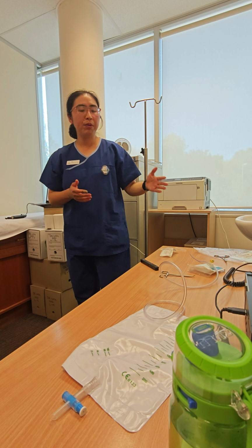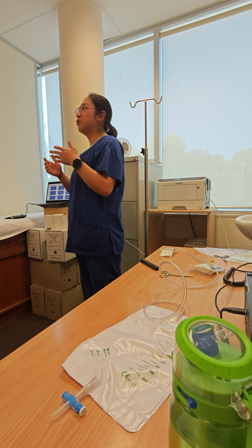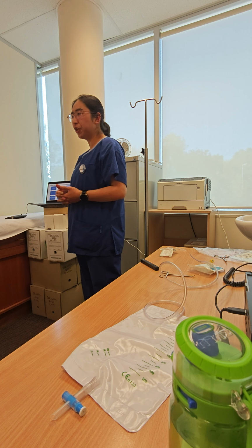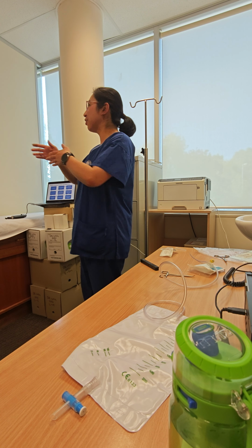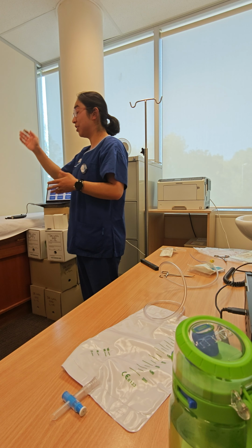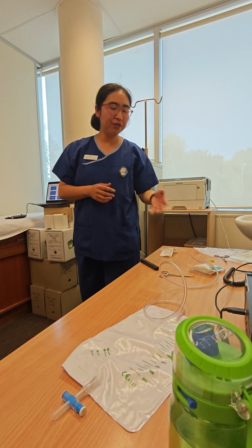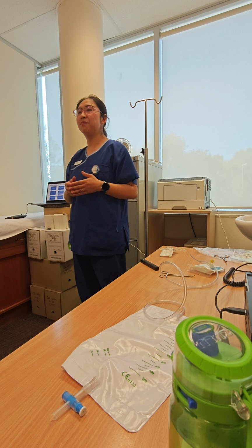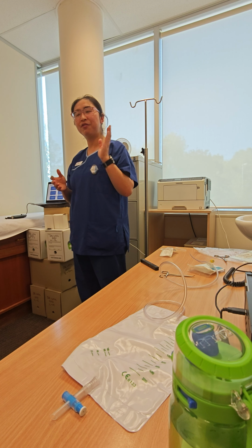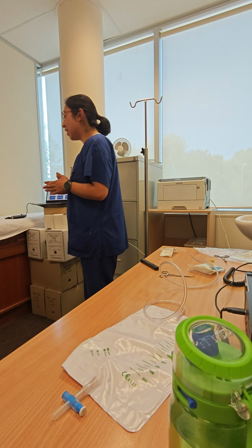What are we going to do? We might call the patient's surgeon to double check and get the authority to remove the catheter from their body. Once it's approved, we go into our nurse in place and ask our nurse to help us remove the catheter from the patient. And we're going to say bye to our patient and tell him everything is all good. You're going to have your report in 24 hours. That's it, that's all done.